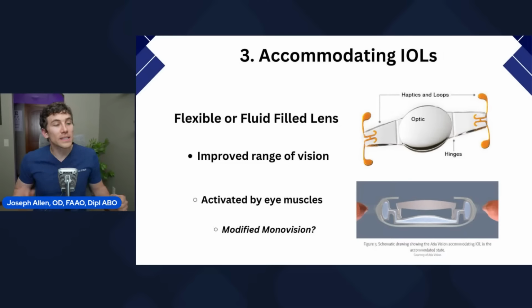So the first one, let's talk about accommodating IOLs. These ones, I do want to mention, I feel like they've lost some favor. They're not as kind of the sexy lens on the market anymore. Maybe about 10 years ago, they were a bigger deal, especially when I was still a student in school. One of the doctors I worked with had awards for implanting many of these options.